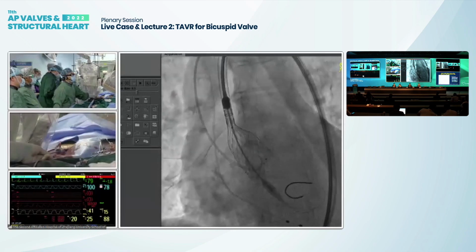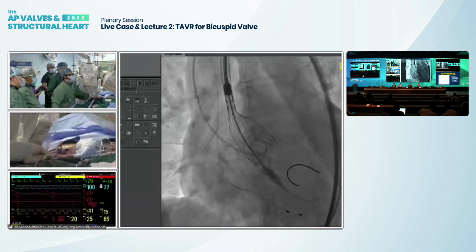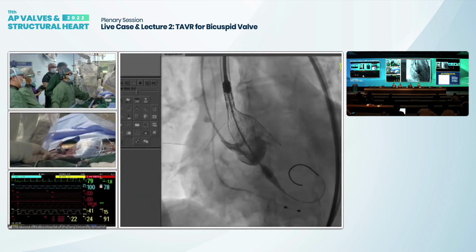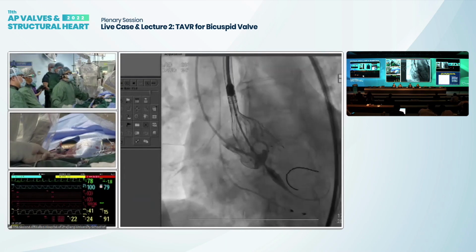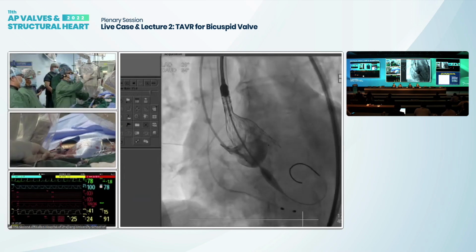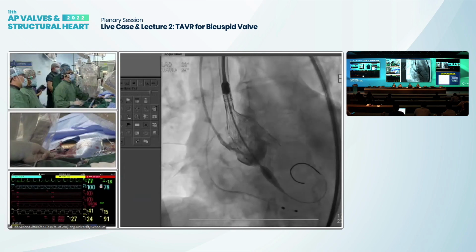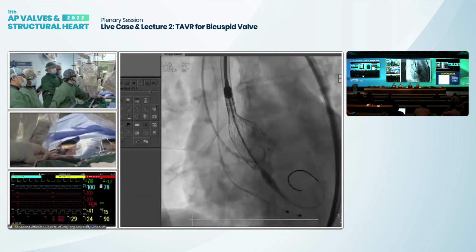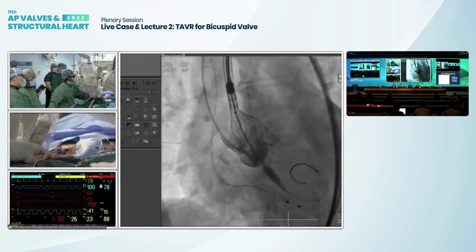The 3 dots help. I said the height should be okay. Too high. The left coronary looks above the annulus. You cannot judge the non-coronary side on this one, but on the other view, the cusp overlap, it looks a little high already.